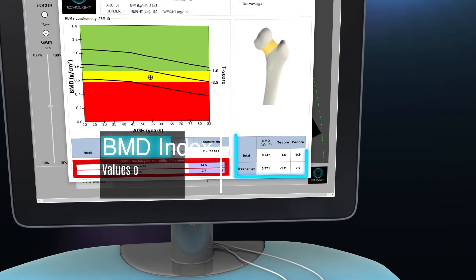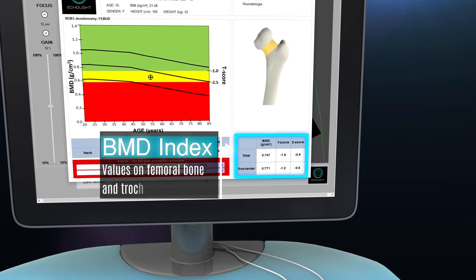The BMD, T-score and Z-score values of total femoral and trochanter are displayed on a bottom-right chart.